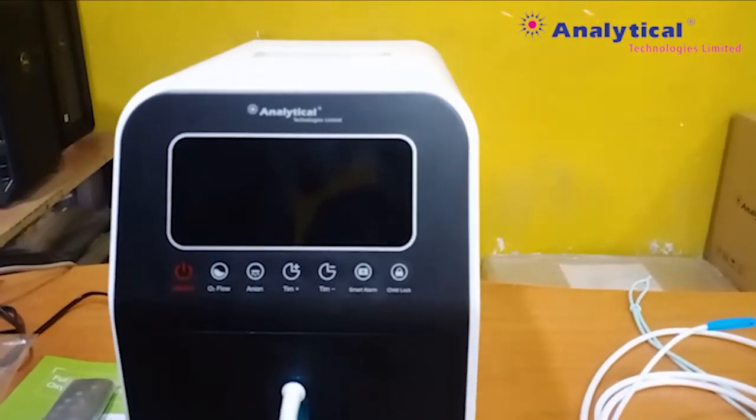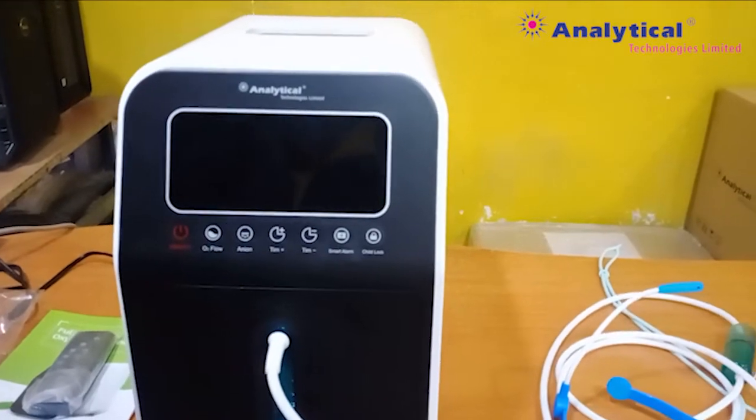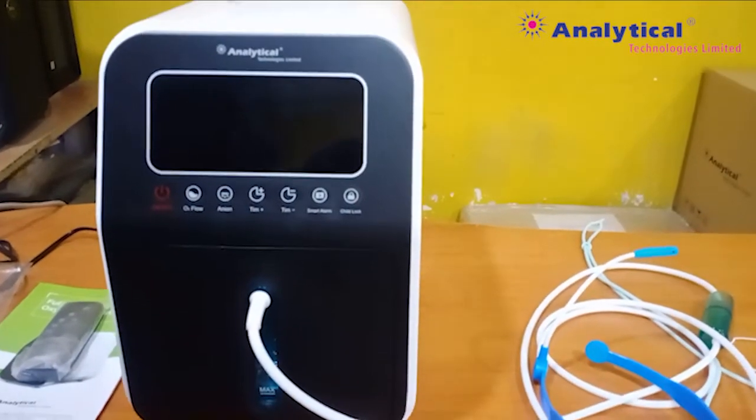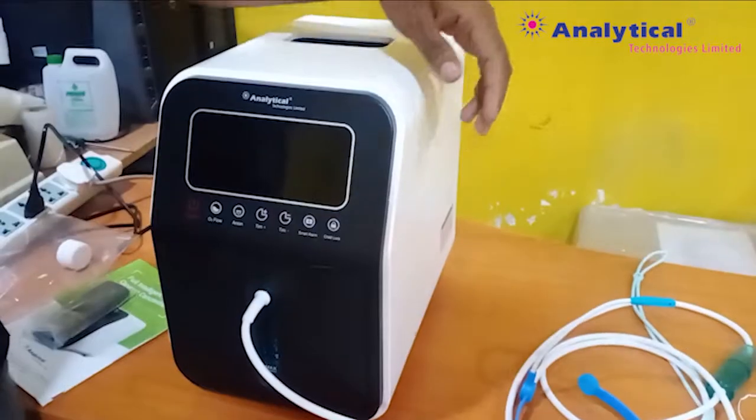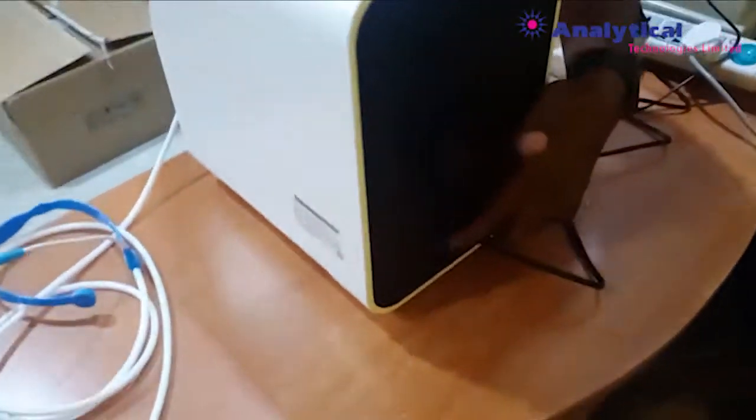Welcome to Analytical Technologies Ltd. This is our Analytical Oxygen Concentrator, 3005C model. This is our main power point. We will start here.